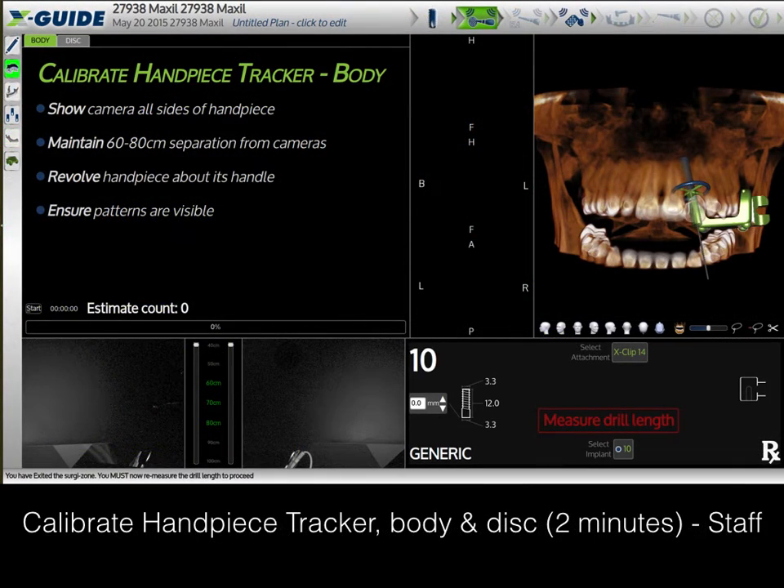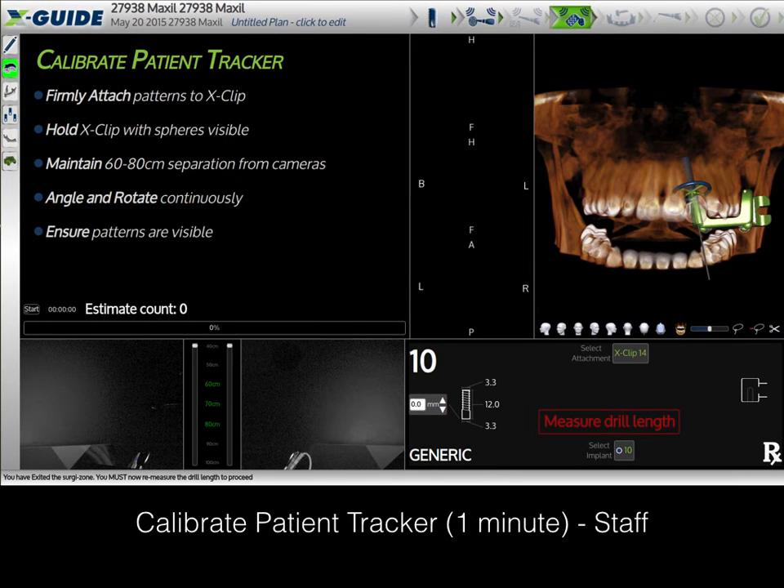The next task across the taskbar is the calibration of the handpiece tracker and body. The menu in front of the staff has all the instructions, so the staff just clicks and follows along — this takes less than two minutes. The next task across the top menu bar is to calibrate the patient tracker. Again, the instructions are listed for the staff and this takes less than one minute.